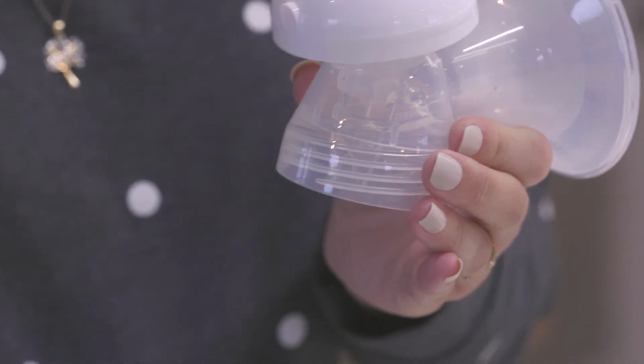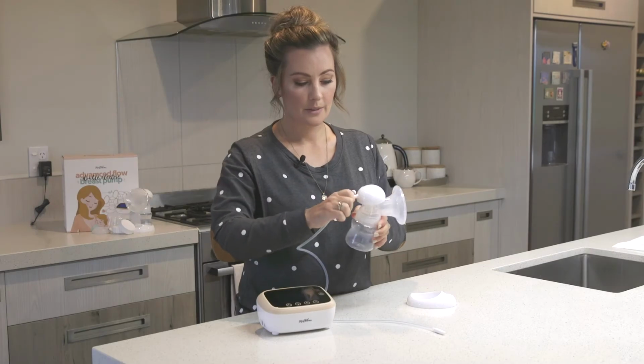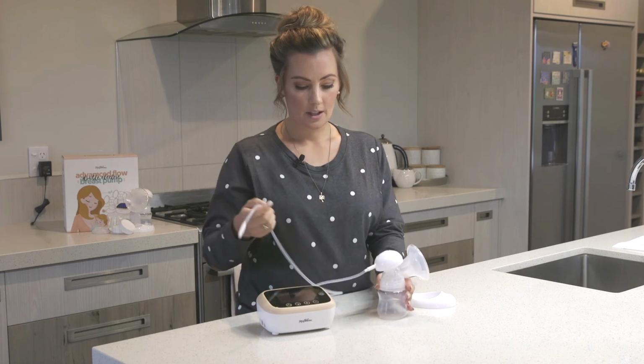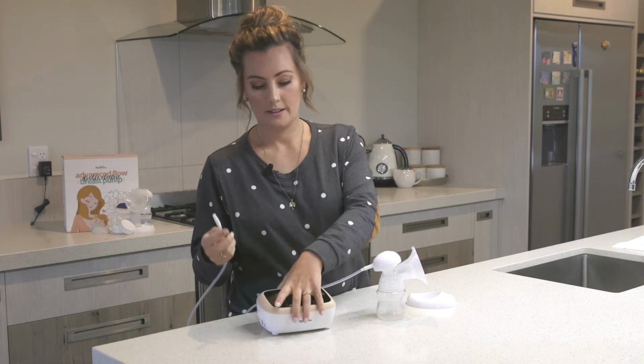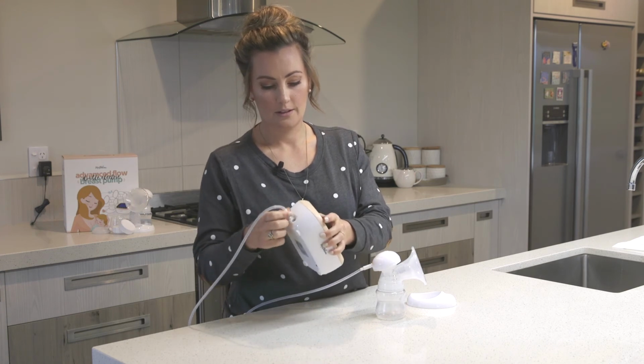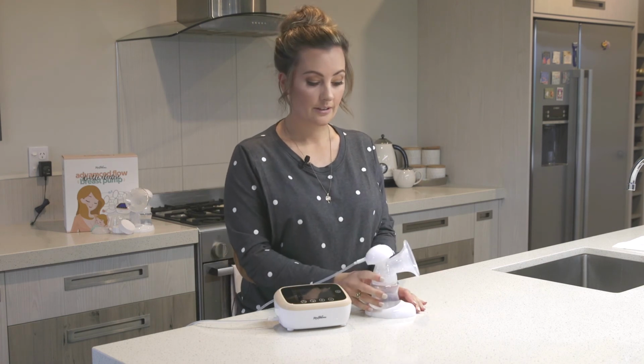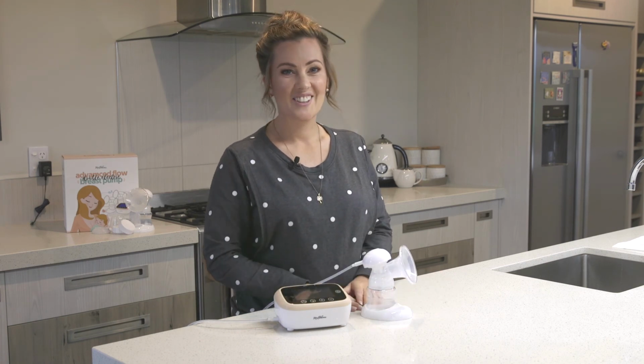Take the tubing, place one side in the back nice and firmly in there, and place the other side into the side of your pump, nice and firmly in there. You can use your bottle stand to ensure that it doesn't fall over, and then you're ready to express.